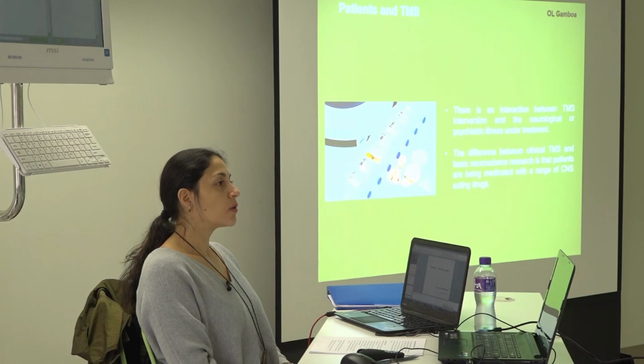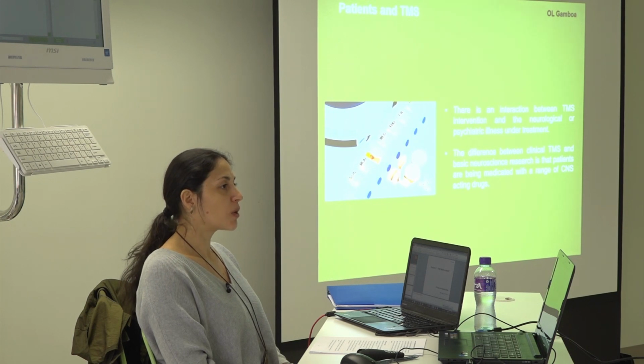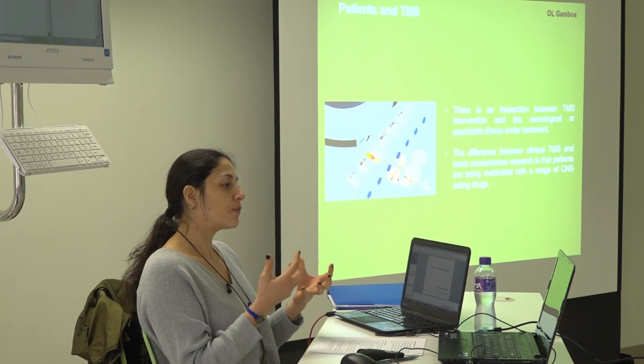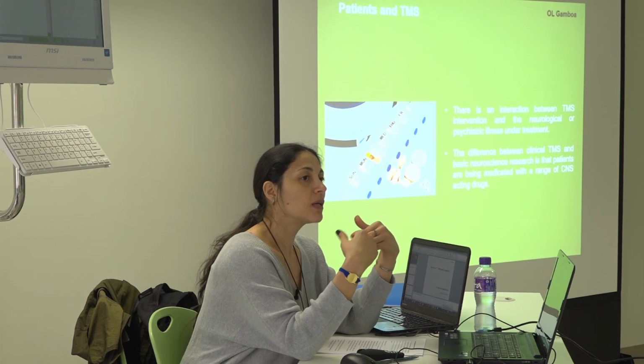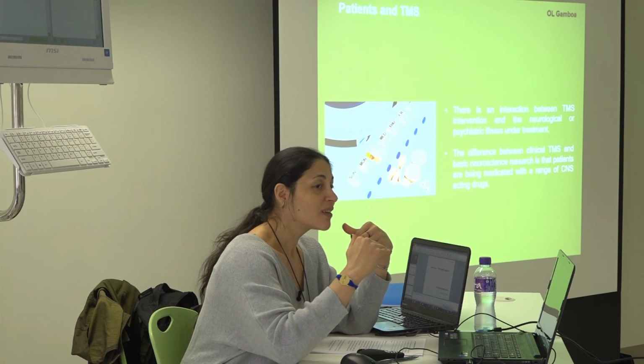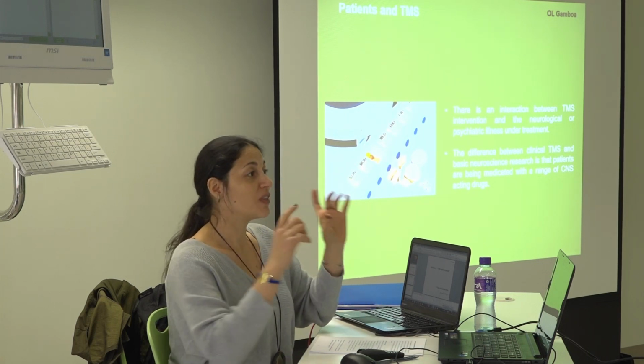Patients, this is really, really important, and also with your healthy participants. Drugs, whether medication or recreational drugs, have an effect and interact with TMS. You don't want to have that, you want to control for that. So the main risk when you are working with patients is the interaction of the drugs with the TMS. Why? Because some of the medication that they are taking will lower the threshold for seizures. As this is happening, you need to take care of what type of medication they are taking.